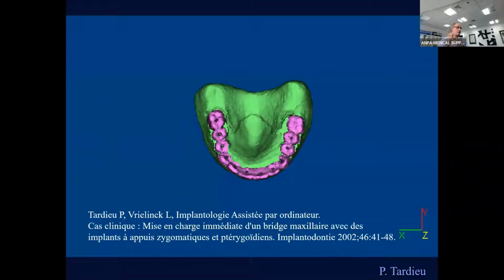Guided surgery, I will talk about next time, but I needed more information about the soft tissue and how to get that on a CT scan with the scanning appliance or the denture of the patient. The internal surface of the denture is the palatal surface. Doing that, we've been able to find a way, because before we could not do it.